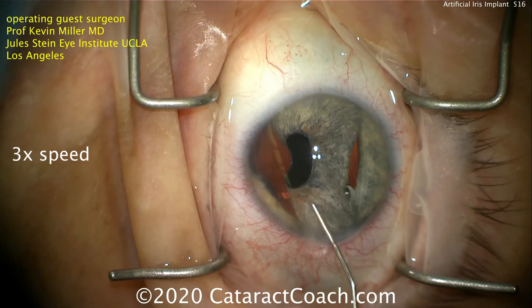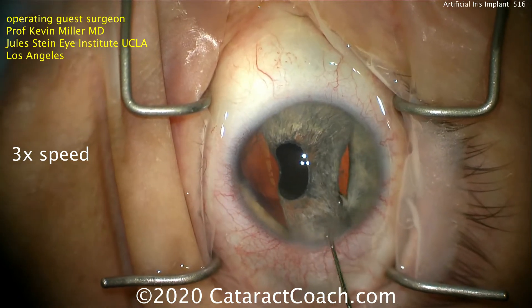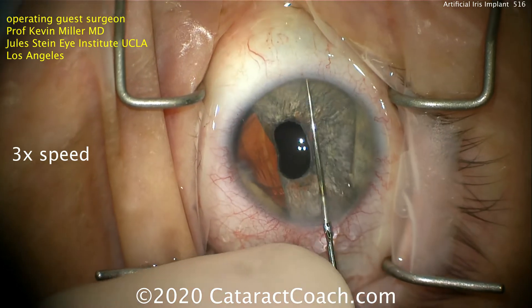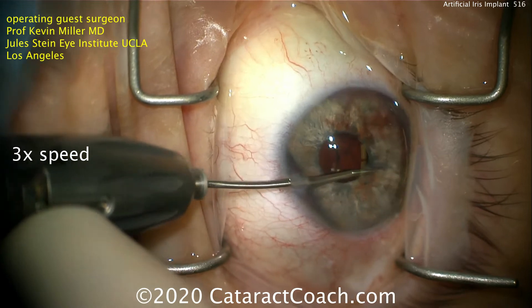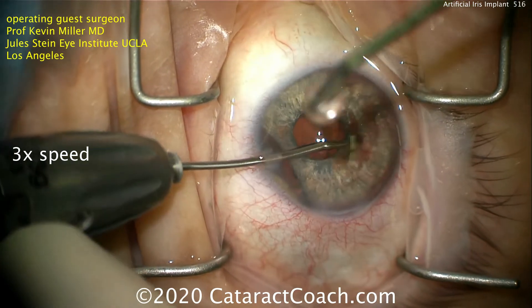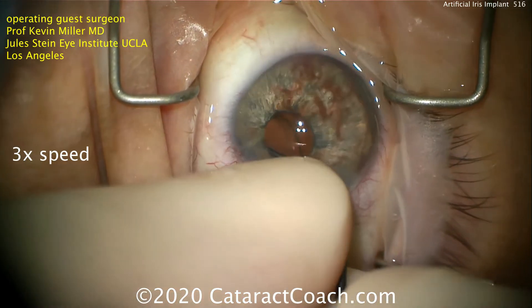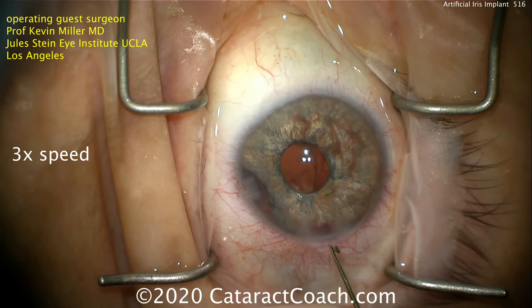He's implanting the Human Optics artificial iris implant in this patient who had a significant degree of trauma. In the video here, he's already completed the cataract surgery, putting in a capsular tension ring, and then putting a single piece acrylic lens in the capsular bag. Now this big implant that's going in — this artificial iris — will need to be placed in the sulcus.